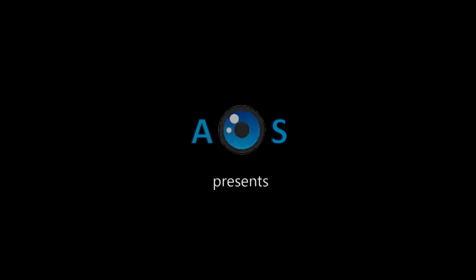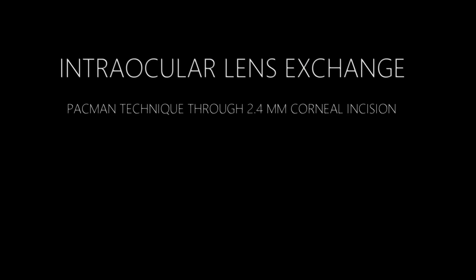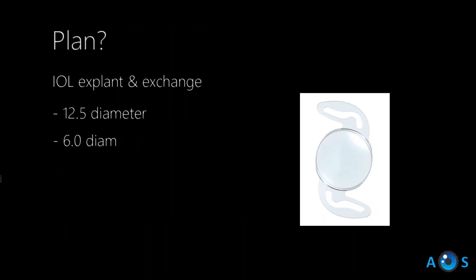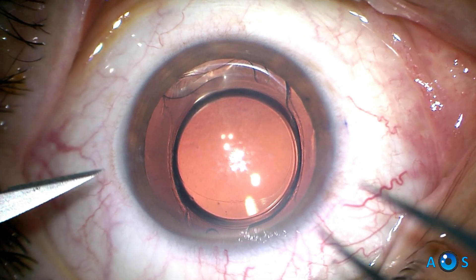In this video, we present our technique for explanting an intraocular lens in a case of refractive surprise, after phaco surgery in a patient with previous LASIK more than 15 years ago. We will use the so-called Pac-Man technique through a 2.4 mm corneal incision, under topical anesthesia.